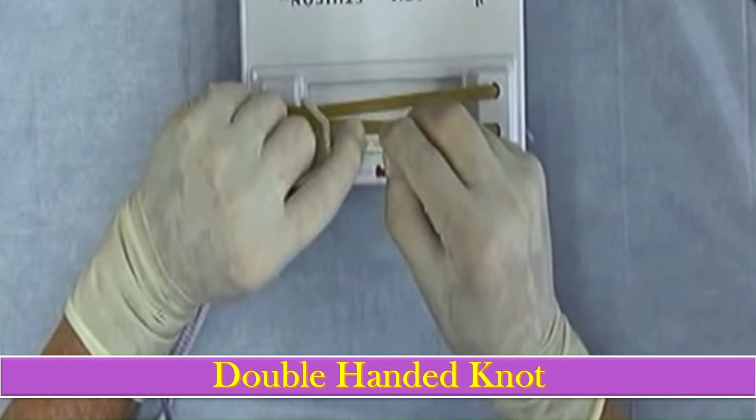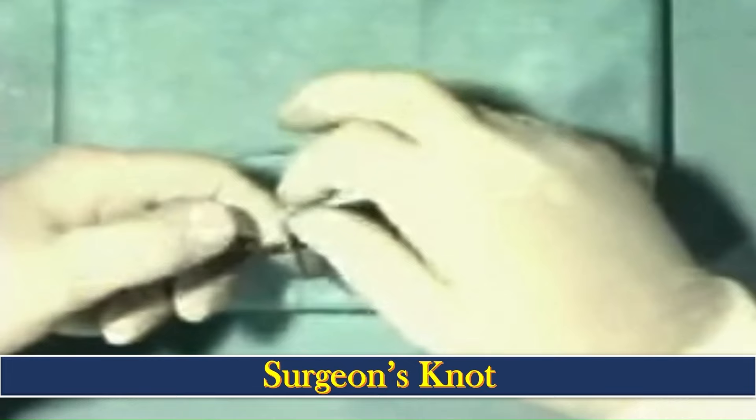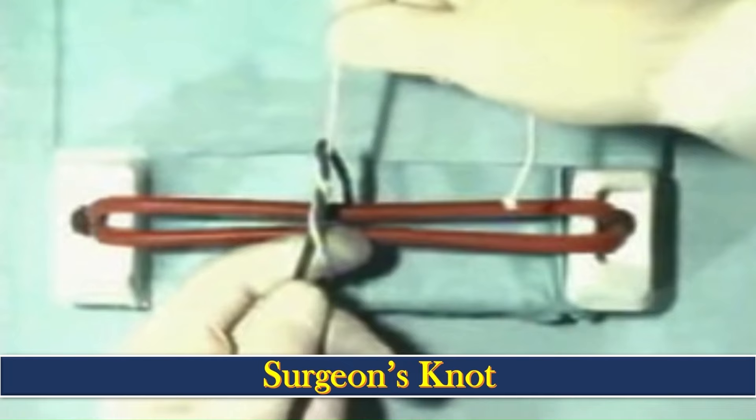Now stick the index finger out, make the half loop with the index finger, complete the loop, go through the loop, and construct the other end. Next comes the surgeon knot, which is a more secure form of the knot. Tie two throws and snug those down, then return to make two more throws, forming a more secure knot — although it is not very pretty looking.